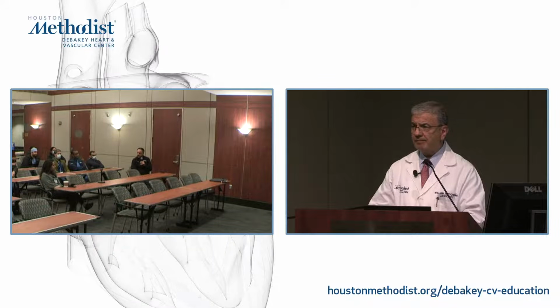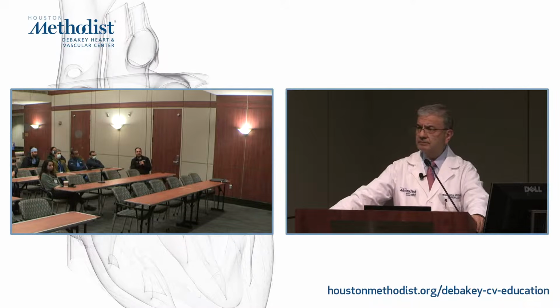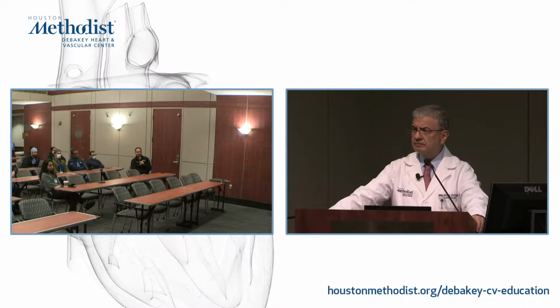I consider myself lucky because I read MRI and I have an idea as to what the ventricular size ranges are for normal and what is mildly abnormal. Sometimes I use those to kind of get an idea as to when I do contrast, what is the size of the ventricle, is it truly enlarged or not.